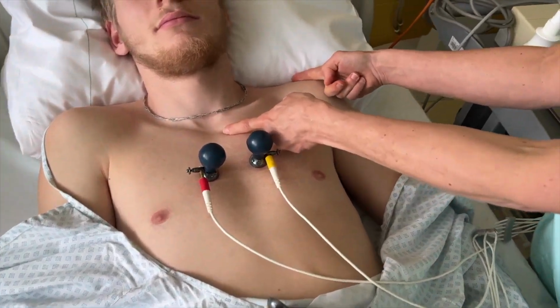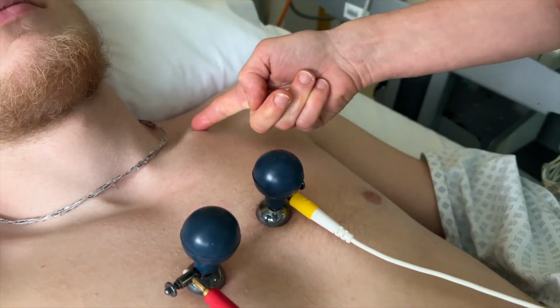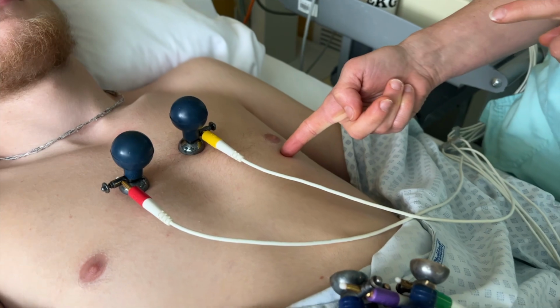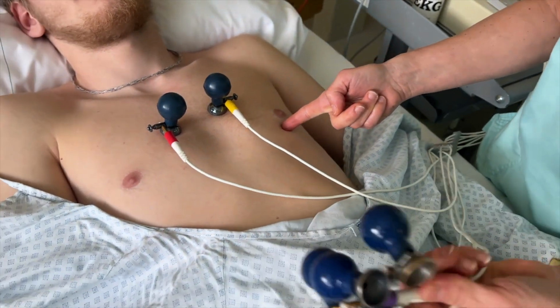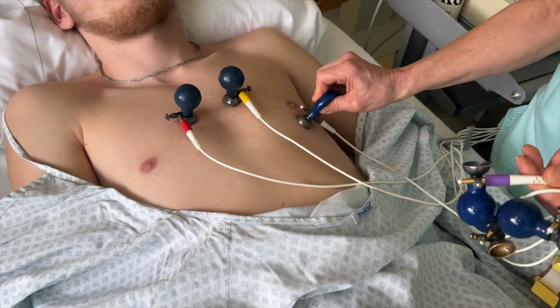We divide the clavicle approximately in half, which gives us the mid-clavicular line. We then place the fourth lead at the intersection of this line and the fifth intercostal space, which in men is located just below the nipple. In women, it is variable.